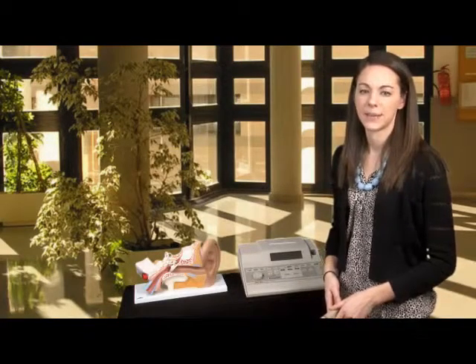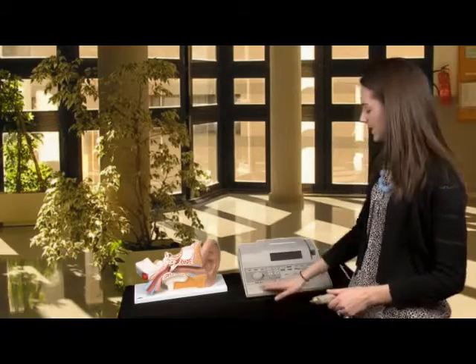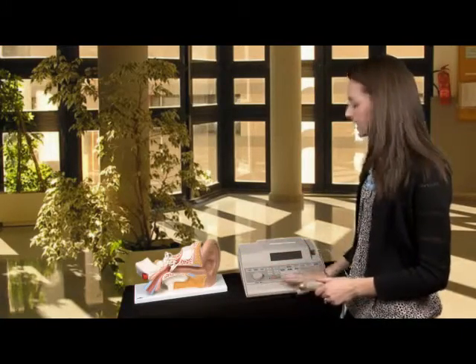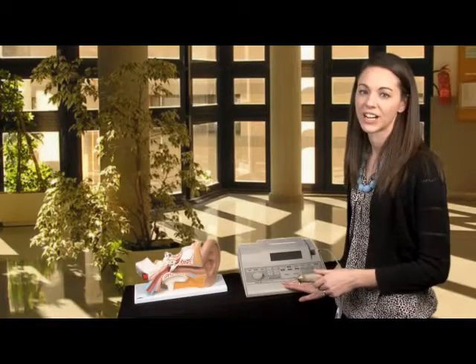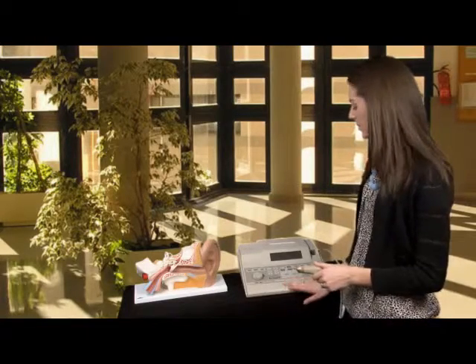This is a demonstration of tympanometry. Tympanometry is the assessment of the tympanic membrane and the middle ear. This is a tympanometer — specifically a screening tympanometer, and there are several different kinds.